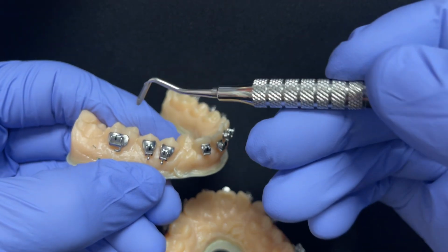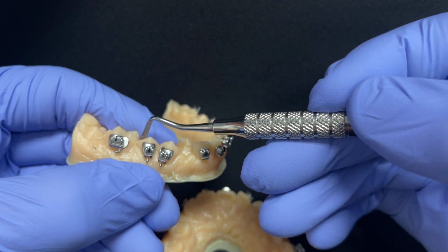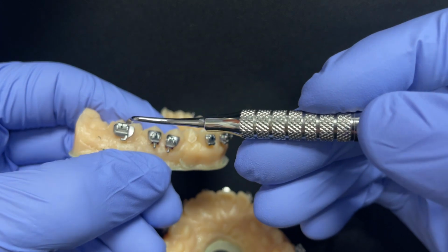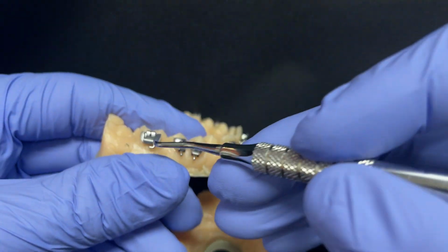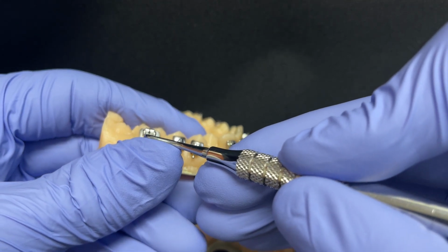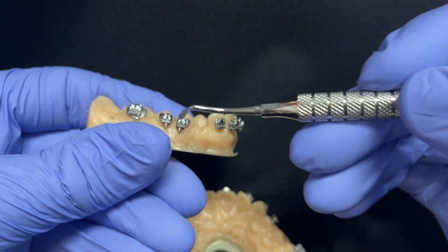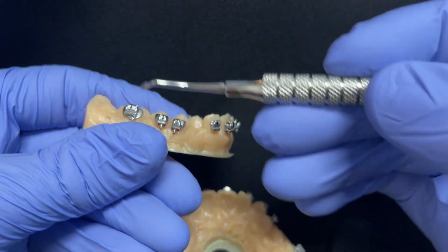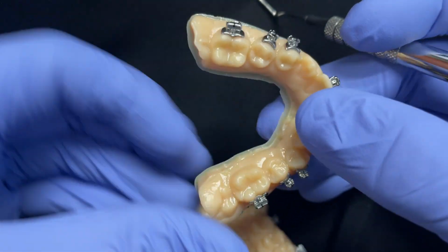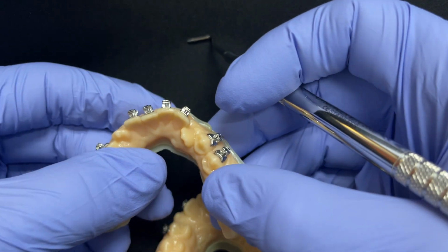So we see a marginal ridge discrepancy here between the 6 and the 5. Therefore, the 6 should be occlusal to the 5, which it is, and perhaps we even scooched up just a smidge more, which also builds a little bit more of that accentuated curve of Spee into the bracket positions. Then we're simply looking at bracket placements here in the anterior.